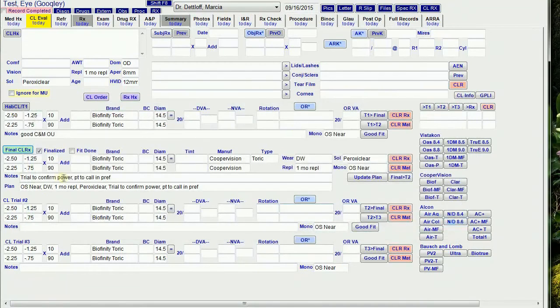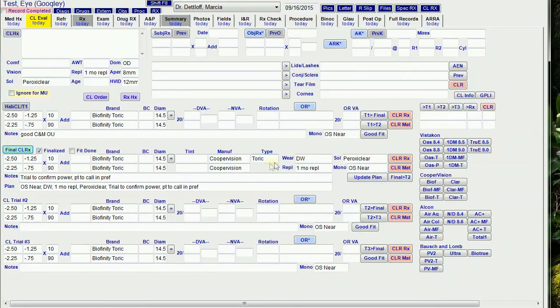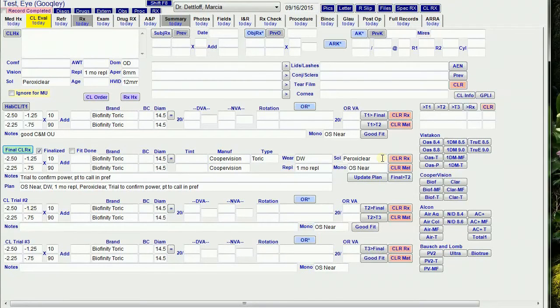It also runs several buttons behind the scenes that set the manufacturer and replacement based on the brand, and the type based on the RX for the right eye. It sets wear to daily wear, and if the solution is blank, it sets it to bio true for daily disposables and peroxy clear for everything else.